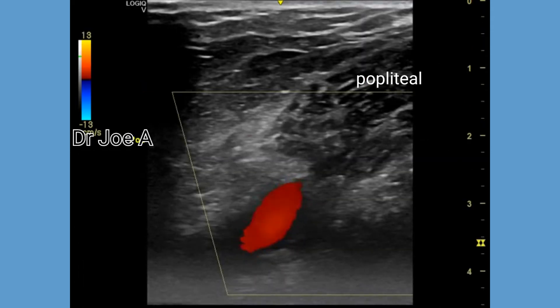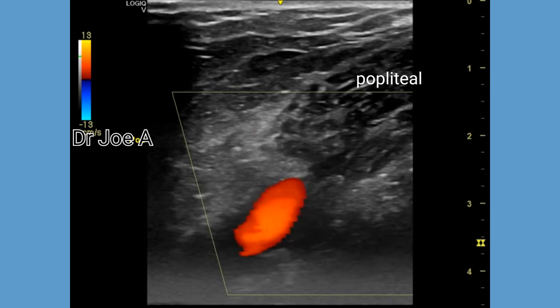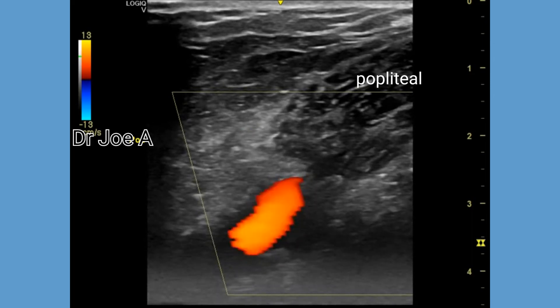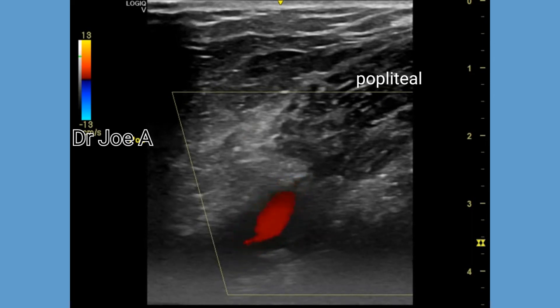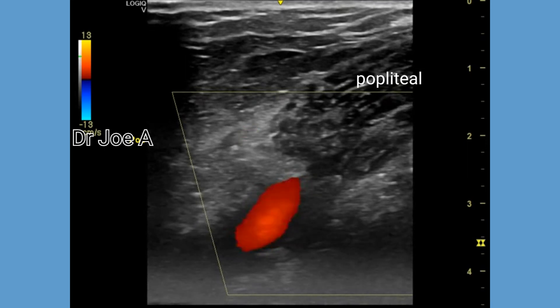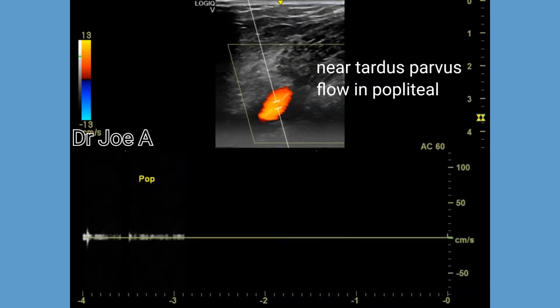The popliteal artery is well visualized, but there is no normal flow. There is a tardus-parvus, markedly dampened flow in the popliteal artery.